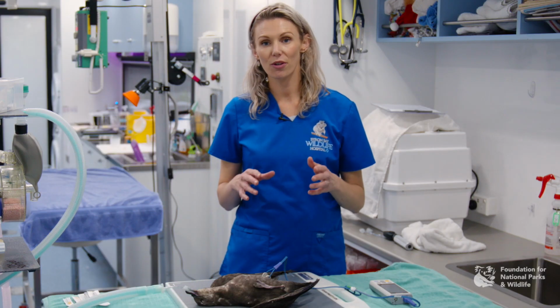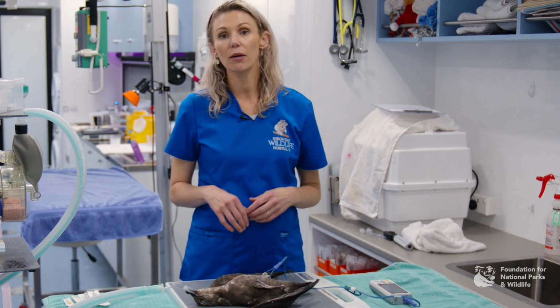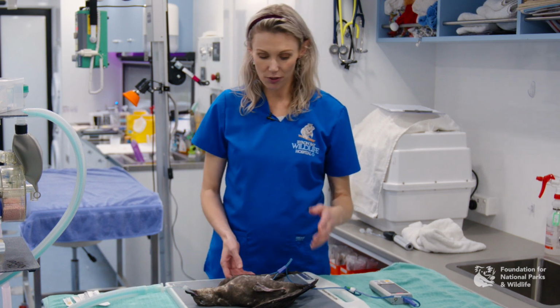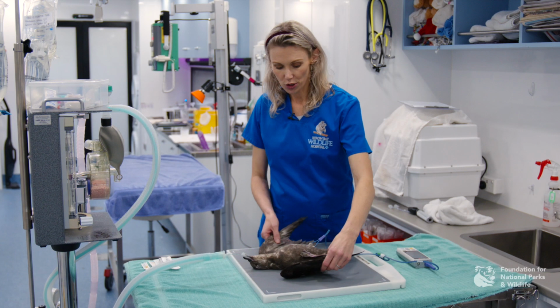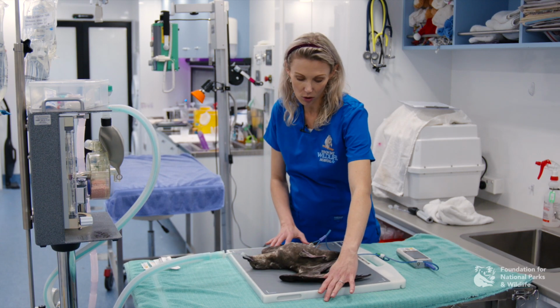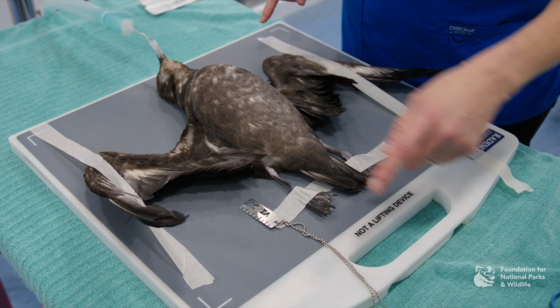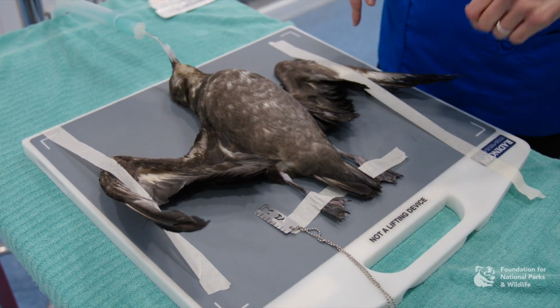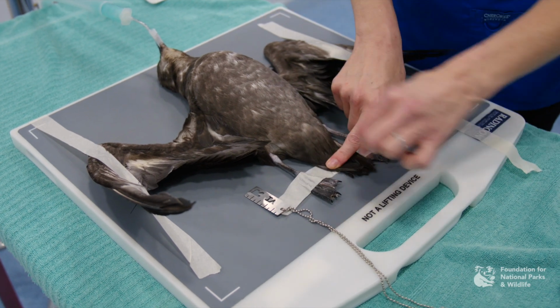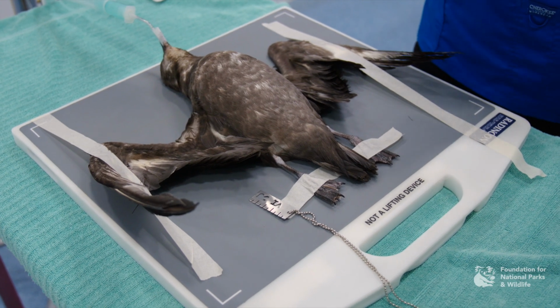To take an X-ray of your bird, you place them on the table and we're going to do two views. We're going to do a VD view and we're going to do a lateral view. The main parts that you need to consider when doing these views is to get your bird symmetrical. So the easiest thing to do is to put the wings out, place your tape down on either wing, and then start with your feet. So what you can see we've done is we've taped both wings, we've kept it nice and symmetrical, and we've taped each foot individually, and that's to help keep the spine nice and straight and your pelvis straight. Remember, always include your marker so that you know which side that you're looking at.